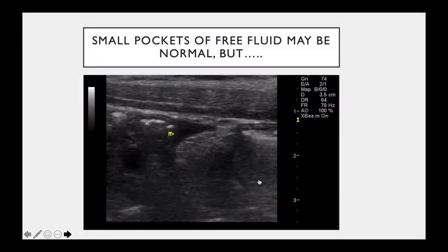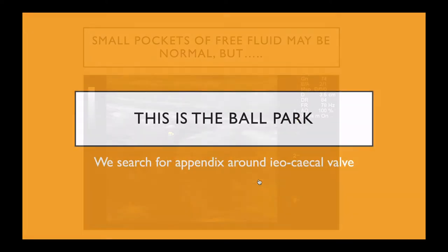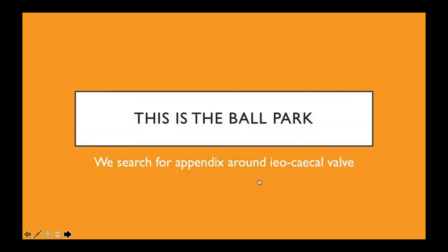A lot of people didn't read the textbooks. I also feel quite confident when I find a tiny little triangle of fluid, which you'll often see sitting right at the end of the cecum. If it's a little triangle, I'm not concerned, but it does tell me this is an area to start looking. Now, I'm in the right ballpark because we like to search for the appendix around the ileocecal valve.